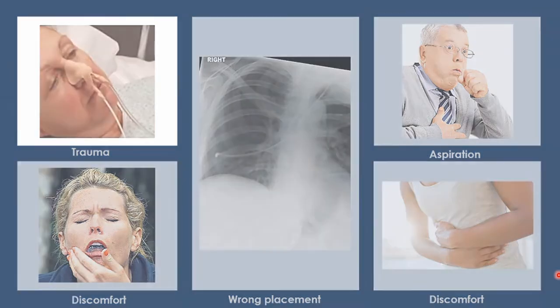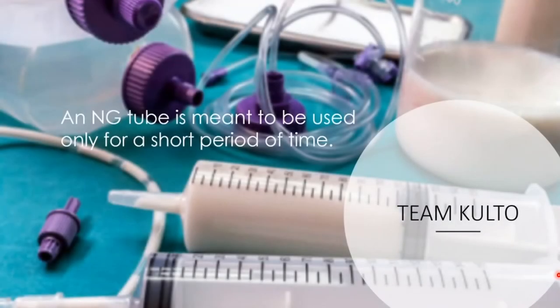Next, an NG tube is meant to be used only for a short period of time. Be mindful of this. Why? Because prolonged use can lead to conditions such as sinusitis, infections, and ulcerations on the tissue of your sinuses, throat, esophagus, or stomach, okay? So this is advisable for a short period of time.